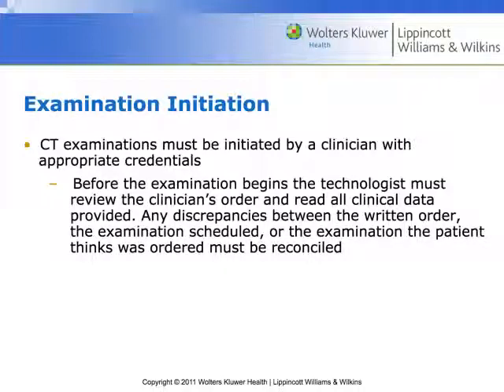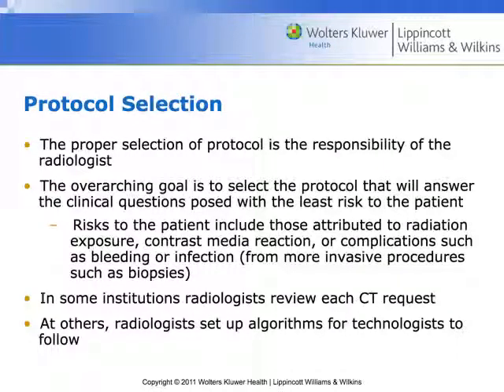Some doctors are open to a technologist calling them up and saying, hey, did you really mean a chest, or an angio chest on this chest CT? Other physicians, there's that whole medical hierarchy garbage. I guess this is going on YouTube. So the proper selection of a protocol is really the responsibility of the radiologist, right?